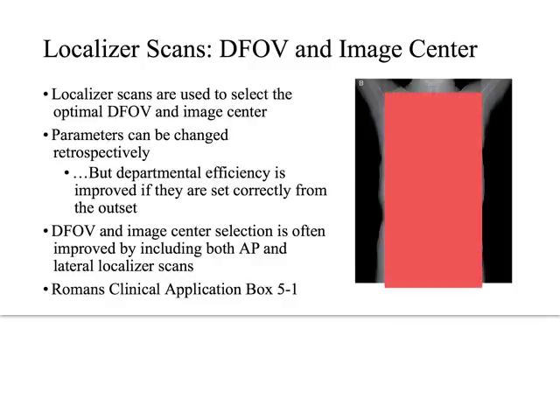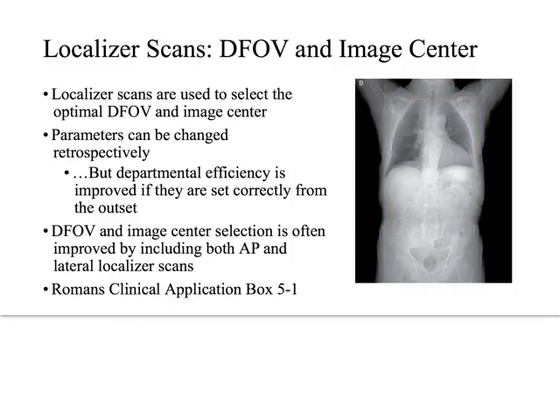And I didn't quite like that because it will not be a solid box, right? But that's the way that it will be drawn on there. It'll draw it on there like this, much better than I can draw it. But it's very precise, the box, right? Anything inside this box is going to be in the display field of view when I look at my CT images. Anything outside of this box will not show up on my display field of view.